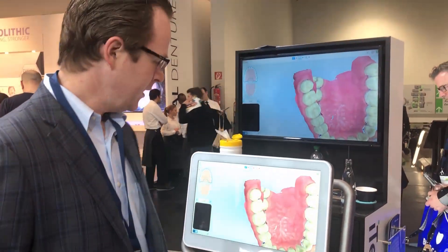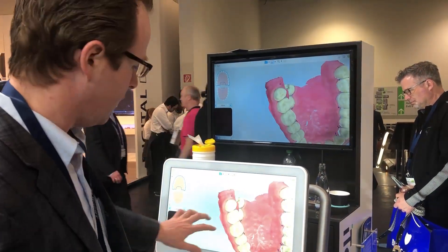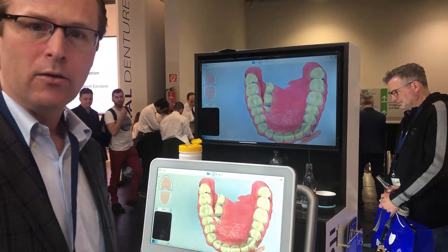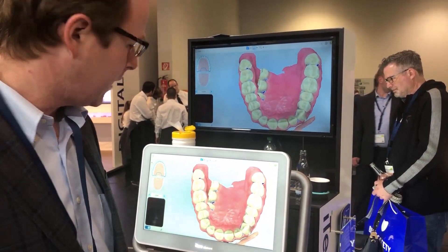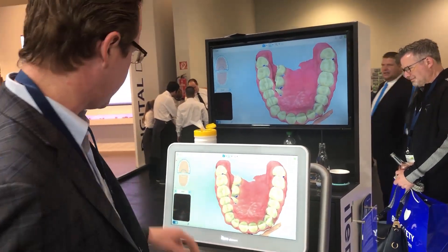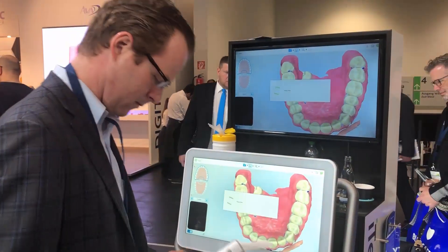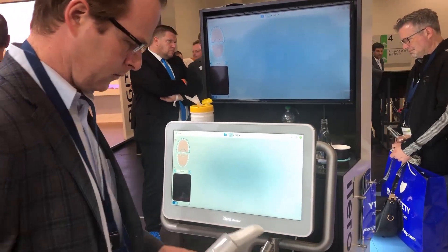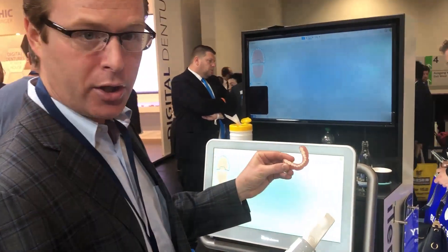One of the things about the iTero Scanner is it has a very intelligent computer algorithm — let's see if it cleans this up. We got a little bit lost there on the palate. Let's go ahead and skip that and go straight to a really complicated scan, which is a denture 360.